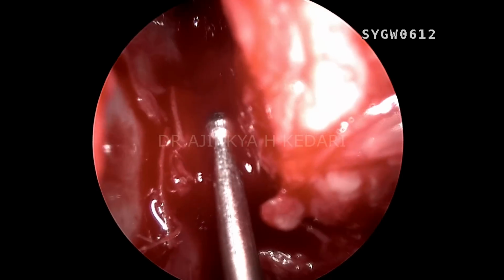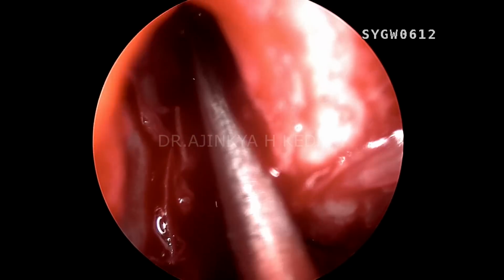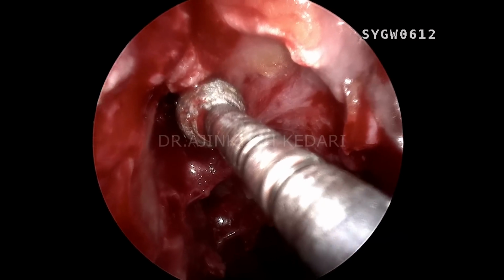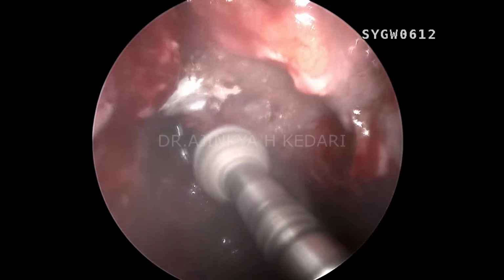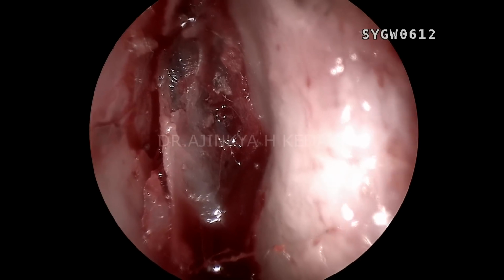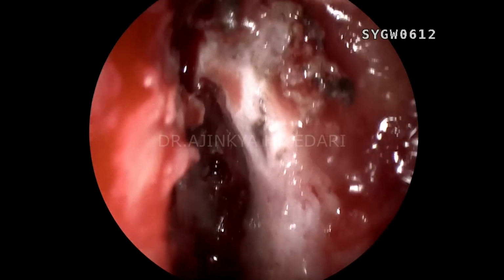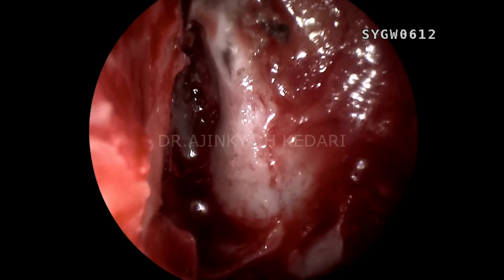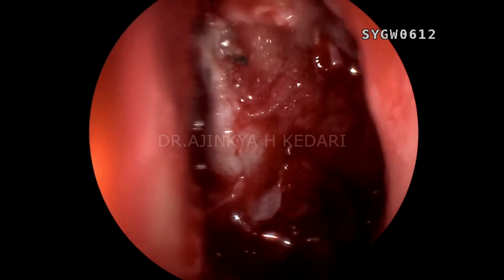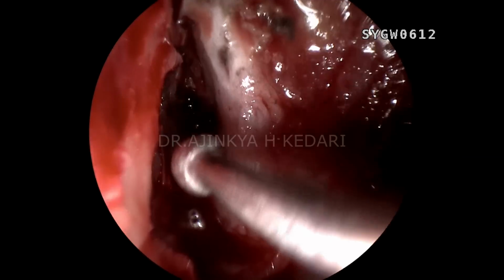So now what I'm going to do is take a 70-degree endoscope, which will give me more superior vision inside. And before I do that, I'm just going to drill that skull base bone a little bit. This is some irregular bone. Now, this is a 70-degree endoscope facing upwards, and what I'm trying to show you right now is that skull base. So this area is basically lateral. This is the patient's right side. It is more towards the orbit, that is the lamina superiorly. That's the original site we've repaired.